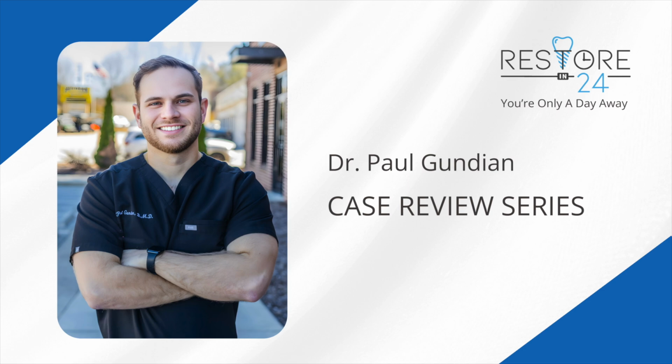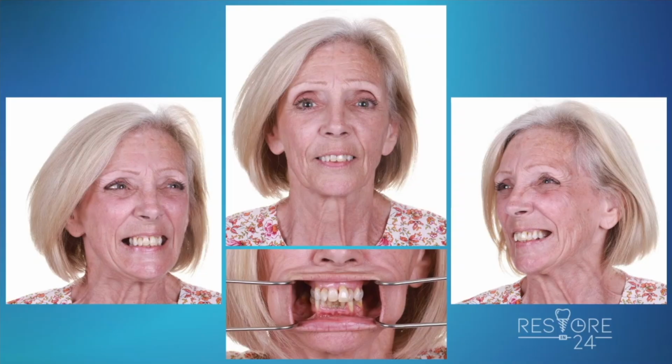Everyone, this is Dr. Paul Gundian with Restore in 24 Dental Implants, and today we're going to go over one of our patients as part of our case series study. So today we'll be talking about our patient, Miss Peggy. And here's Miss Peggy. She came in to look for a full mouth dental implant treatment.